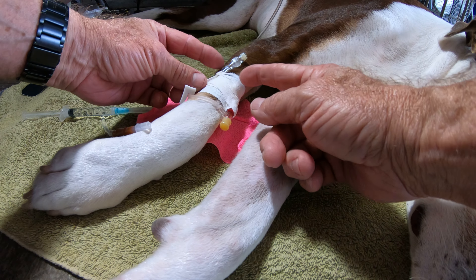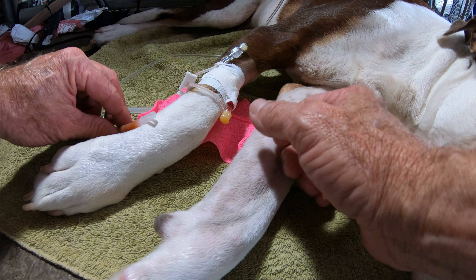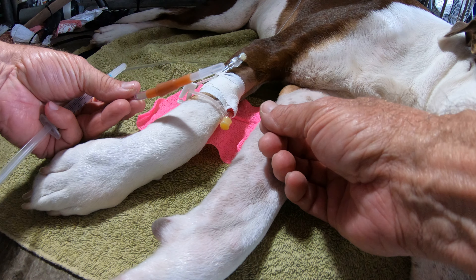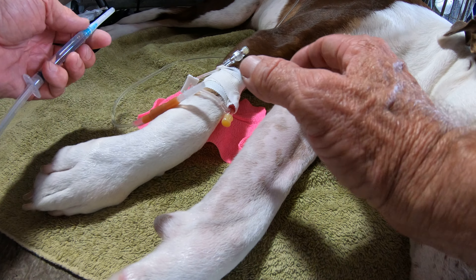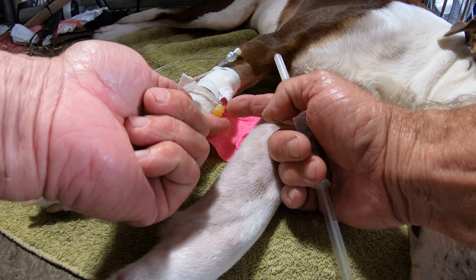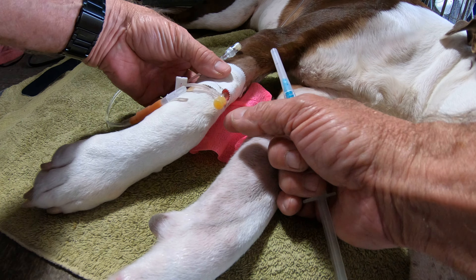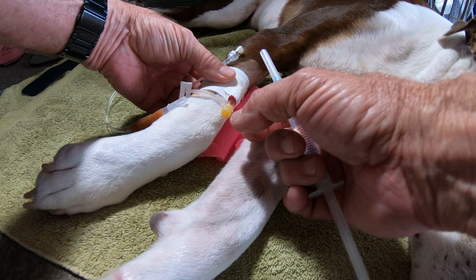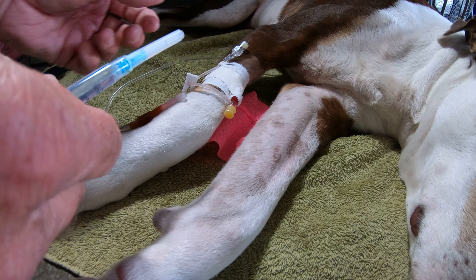I've got this catheter line purged of air. I've got the IV fluid line, the drip line — it is also purged of air. It's ready to be hooked up. Actually, there is a bubble in the catheter from the veterinarian. There's a bubble in here and I'm going to try to remove it because it's a pretty big one.